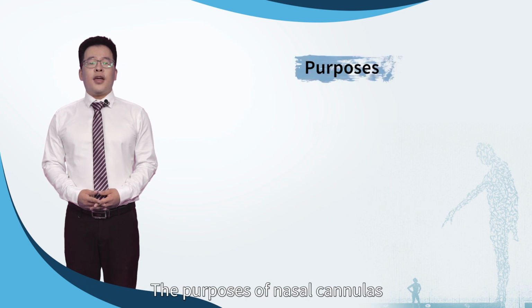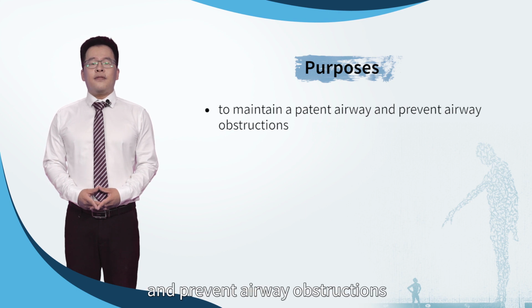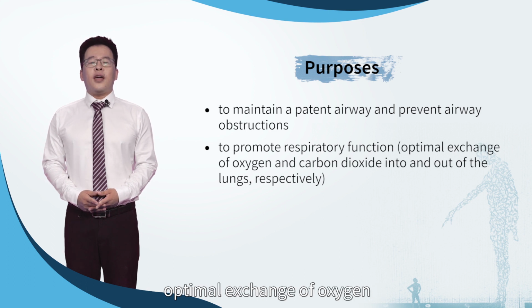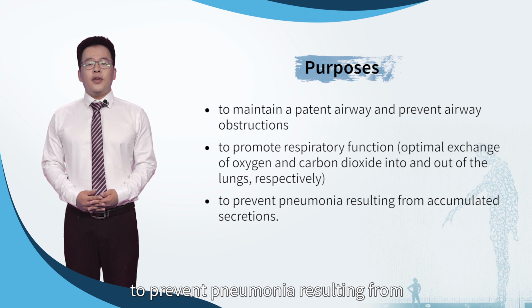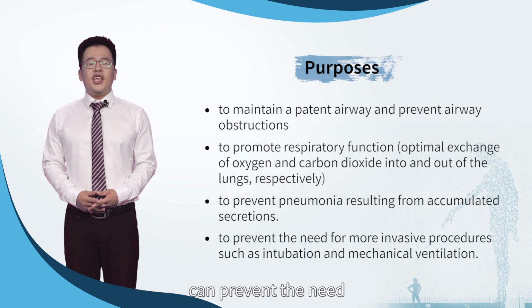The purpose of nasal cannula and face masks is to deliver oxygen as needed for patients, to maintain a patent airway and prevent airway obstructions, to promote respiratory function, optimal exchange of oxygen and carbon dioxide into and out of the lungs, respectively, and to prevent pneumonia resulting from accumulated secretions. Prompt treatment of these conditions with non-invasive oxygen administration can prevent the need for more invasive procedures, such as intubation and mechanical ventilation.